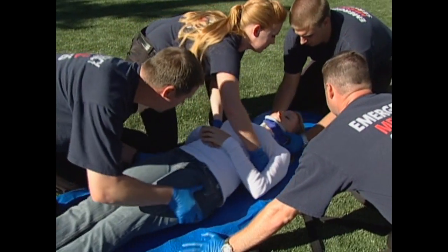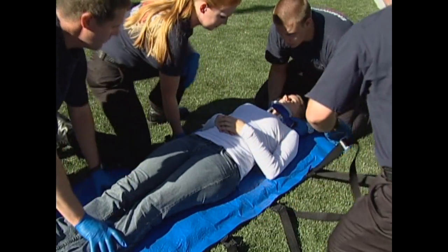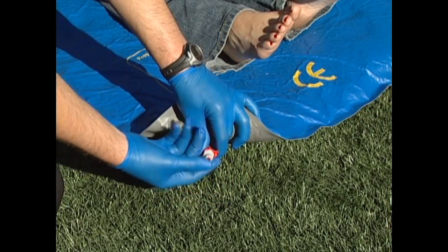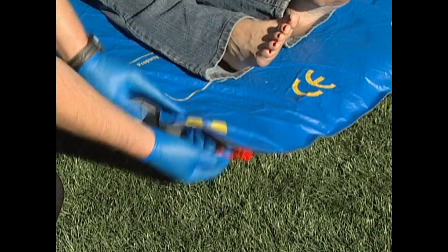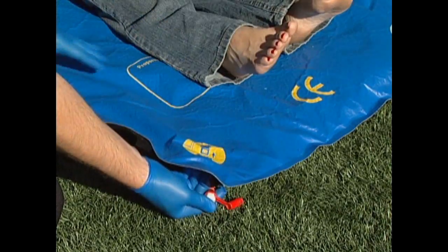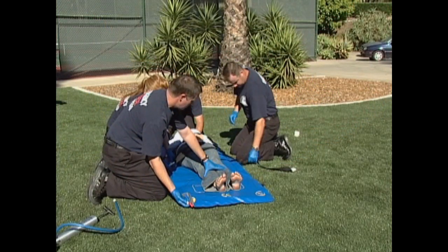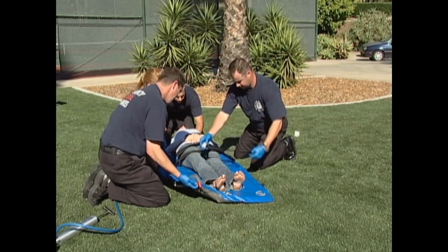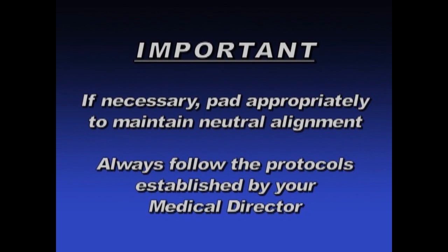You can then move the patient, along the long axis of their body, into a position that is centered on the mattress. Open the maxivalve at the foot end, allowing air to enter. Keep the maxivalve open until the mattress softens and begins to conform to the shape of the patient. It may be necessary to move beads either away from or under the head of the patient, depending on the anatomy of the patient. Make sure there are sufficient beads to maintain neutral alignment. If necessary, pad appropriately to ensure neutral alignment.